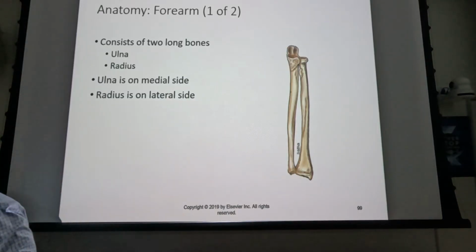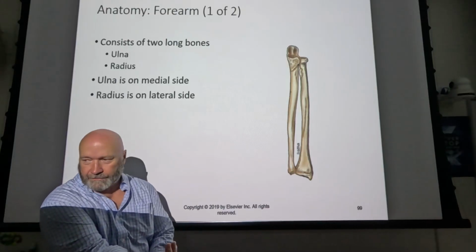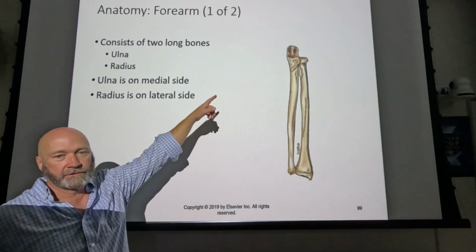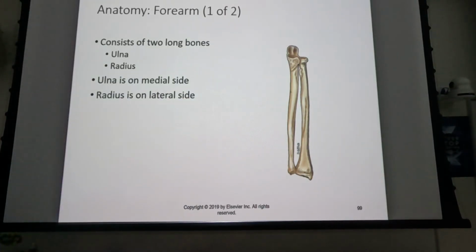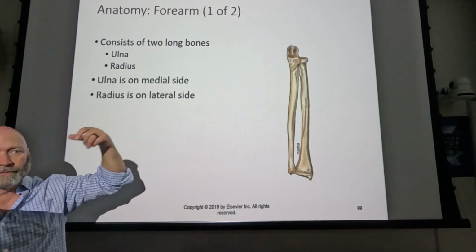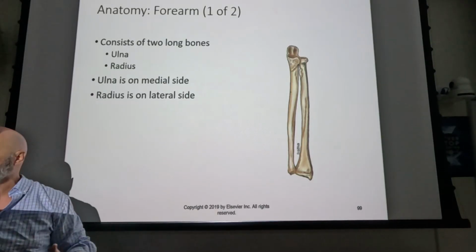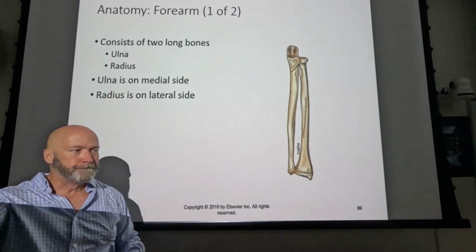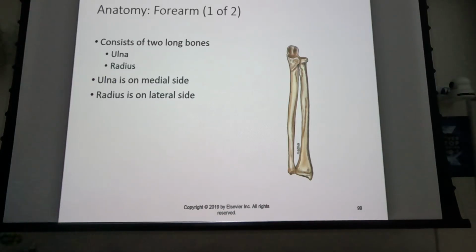What you don't want to do is have the patient sitting upright and their elbows out like this, okay? Because the problem there is that you're going to get superimposition over the proximal portion of the ulna. That's what we refer to as the olecranon process. The olecranon process is going to have superimposition, more soft tissue over it and over the proximal radius and all that. So you want it fully extended, if at all possible, and the palm upright.